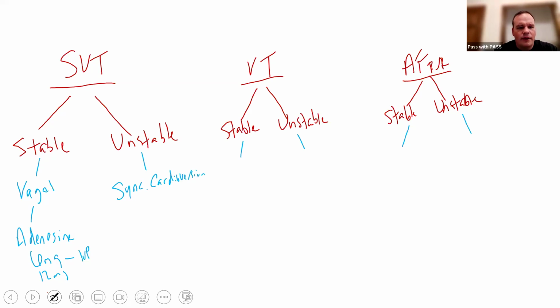Now, for these patients, SVT, the starting dose is 50 to 100 joules. And then 200, 300, 360. Now, the way I've always taught my students is start at 50, right?